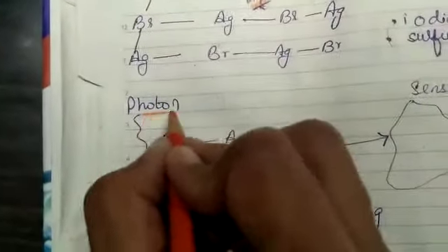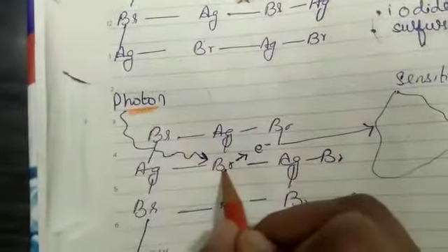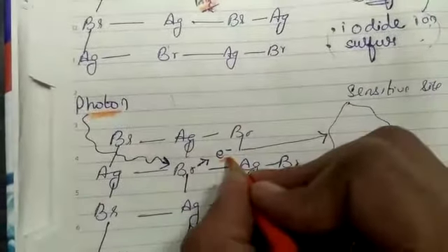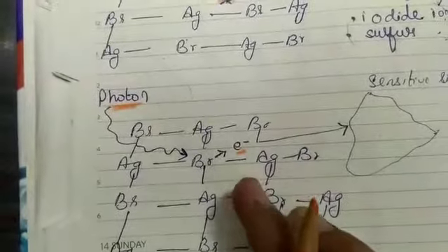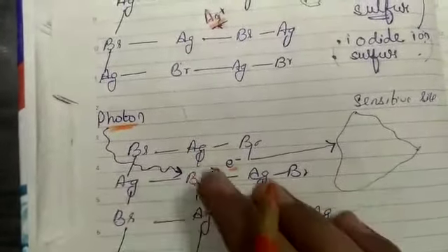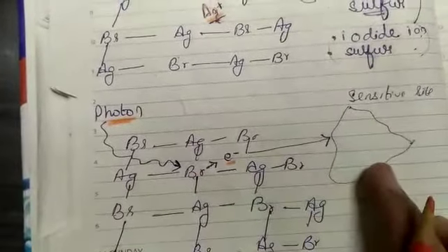This is the second diagram. You can see that when the film emulsion is exposed to the X-ray photon, it hits the bromide and an electron is released. Now what will this electron do? It roams around in the film emulsion until it reaches a sensitive site. So the main target is to reach the sensitive site.